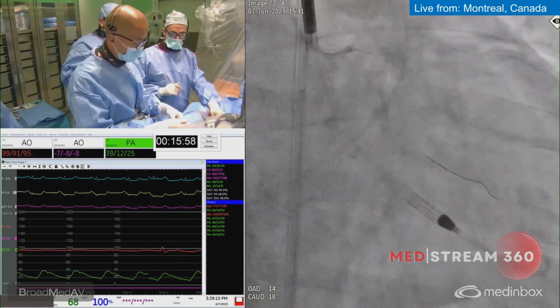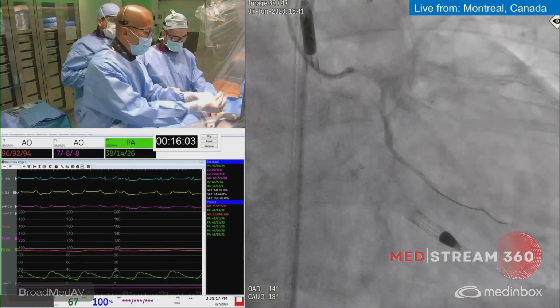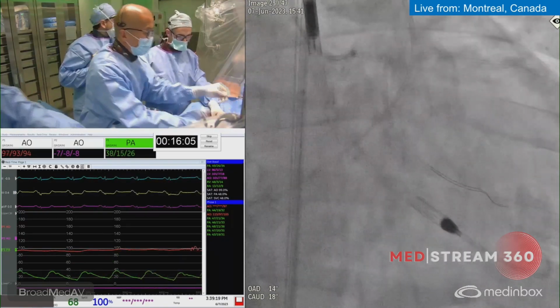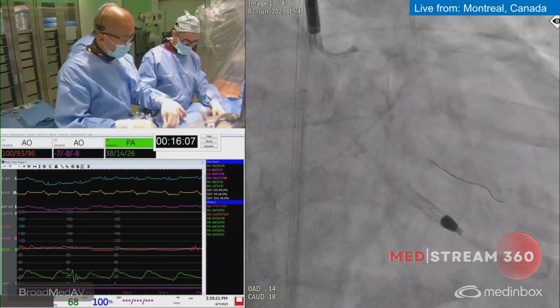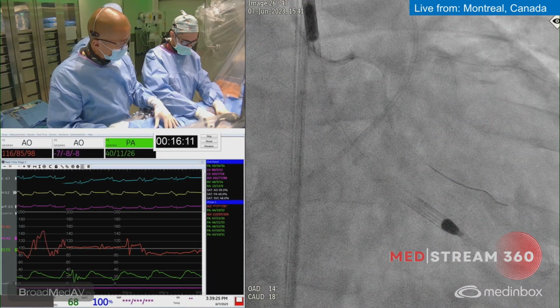If not, then we have to believe that maybe the distal LAD is compromised. If it's not that flap, we'll go from the balloon to this perforation, LAD. But balloon rupture, it might be the distal LAD, but I think we sized it accordingly, and we will see.